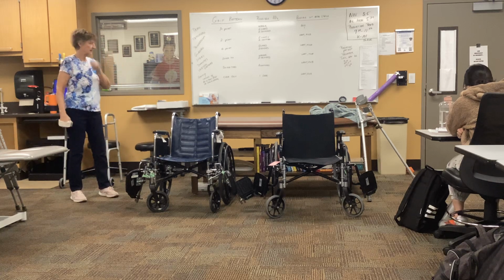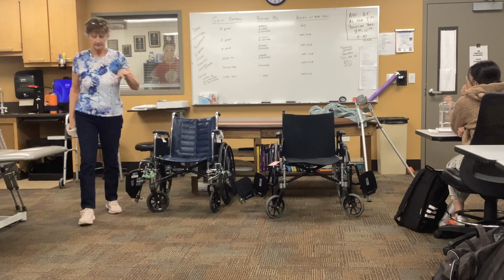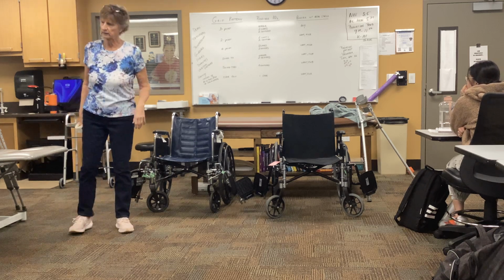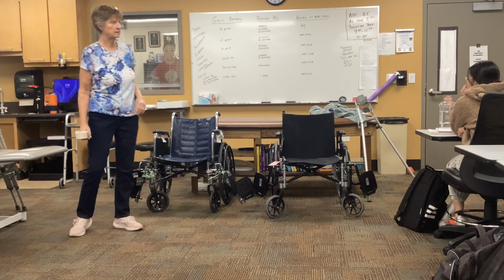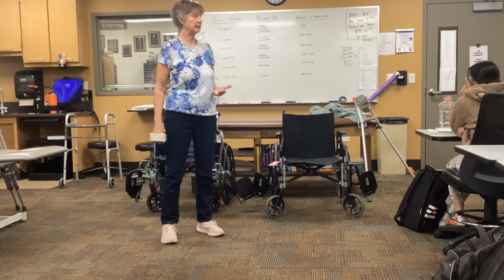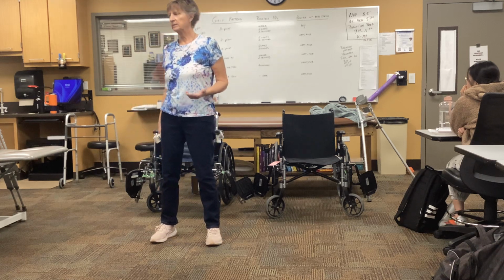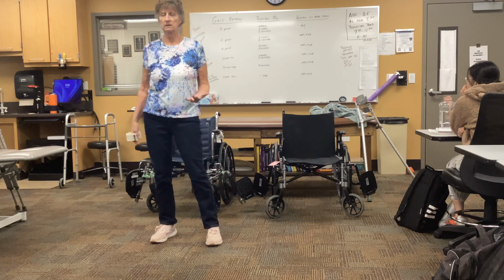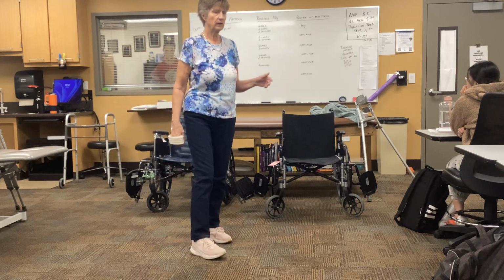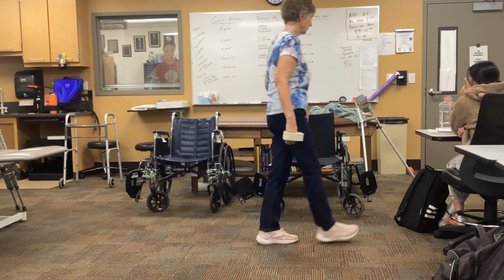Typically, as I said, a patient might have long leg braces on and use this particular pattern. So this is somebody who is typically our long-term user of crutches, and most often they will be using forearm crutches.